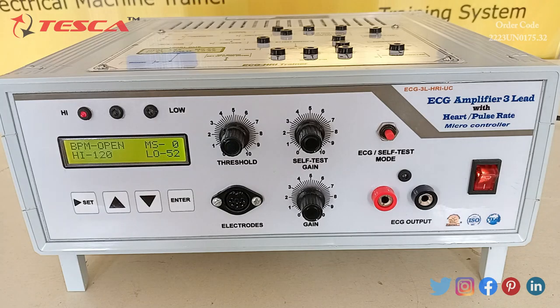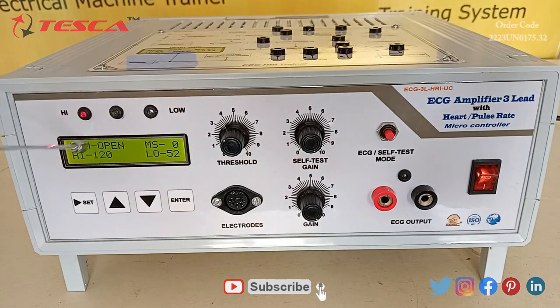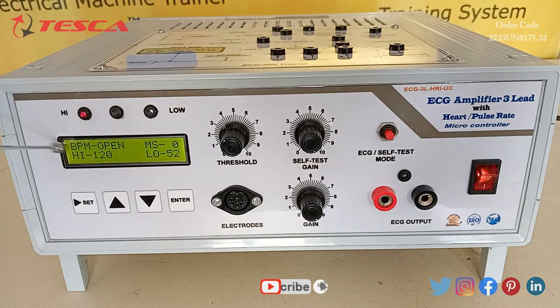With the help of this apparatus we can check the BPM of any person. Now I am going to give you an overview of this apparatus. In this apparatus we have a display from where we can measure the value of BPM.